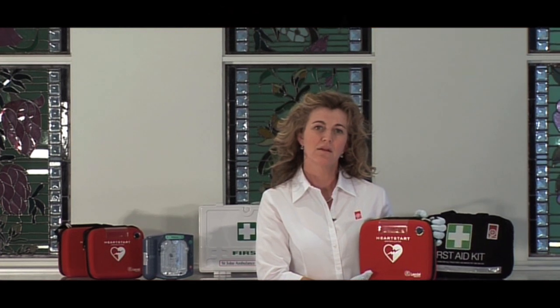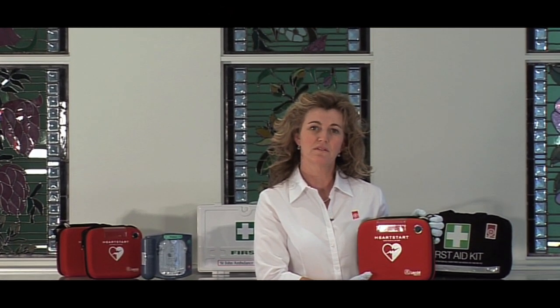This is an automated external defibrillator used for victims suffering a sudden cardiac arrest. There are many of them placed out in public arenas now and I'll just give you a demonstration.